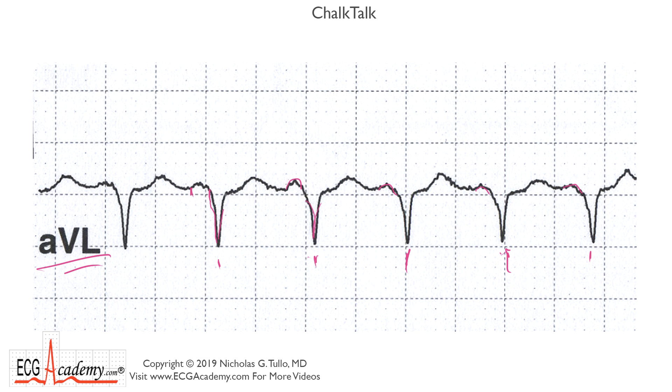It looks like there might be a P wave in front of each beat, but the PR interval just really looks very short — only maybe 100 milliseconds or so. A lot of people would look at this and say, could this be WPW? Could this be some sort of SVT? So what should you do first? Well, the answer is to get a 12-lead.